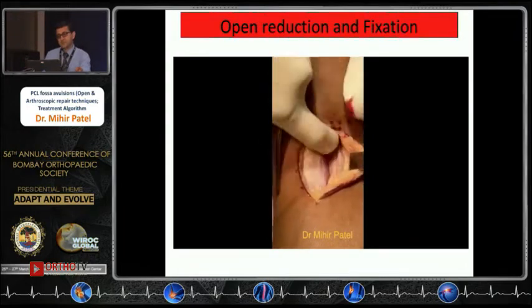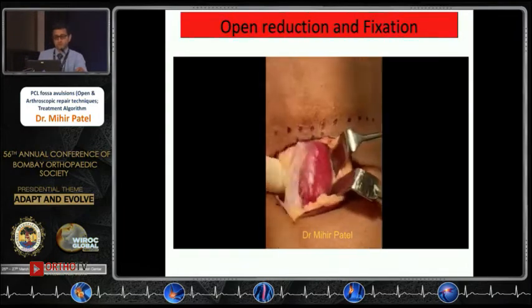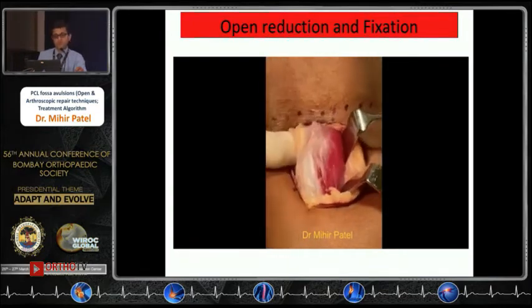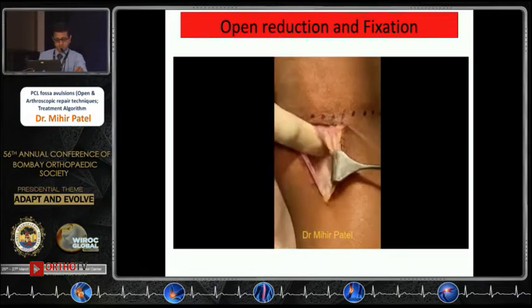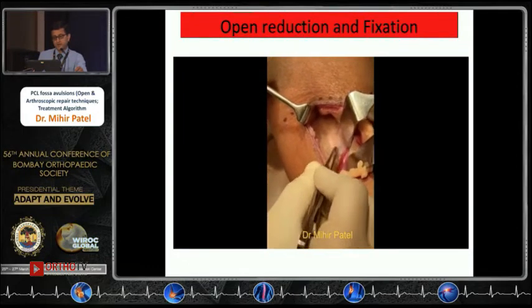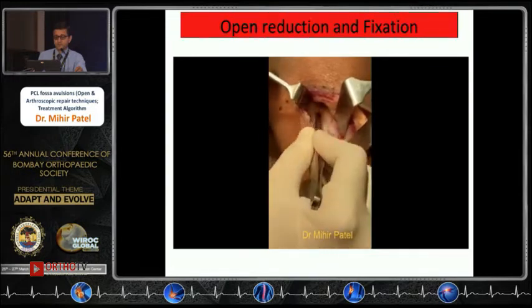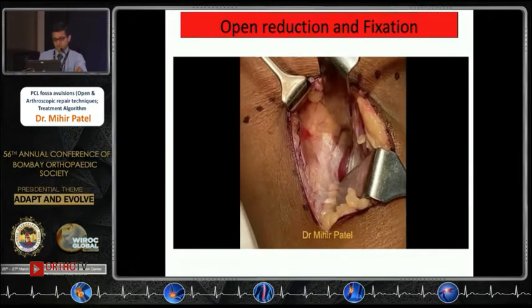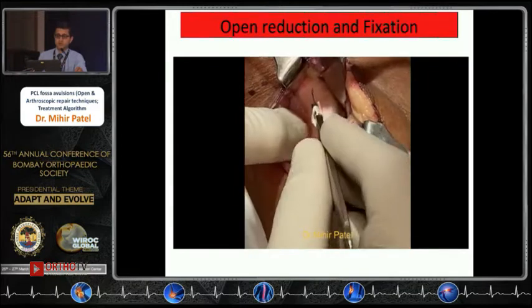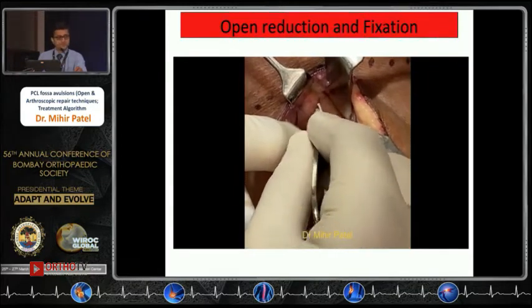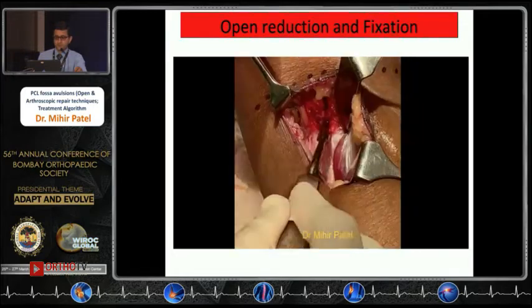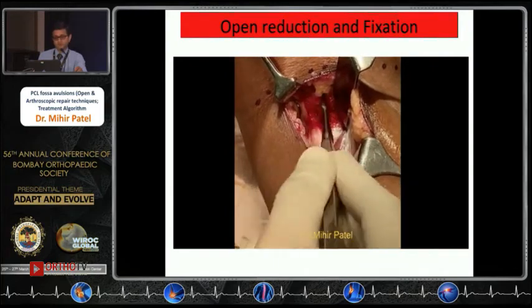The medial head of the gastrocnemius is easily dissected using finger dissection off the posterior aspect of the tibia. The medial gastroc is retracted laterally, taking all the neurovascular bundles laterally, giving direct exposure of the posterior tibia and the avulsion fracture. We identify the geniculate vessel, then the region of the PCL fossa avulsion. An inverted L-shaped capsulotomy is done posteriorly, taking us directly onto the fracture crater.